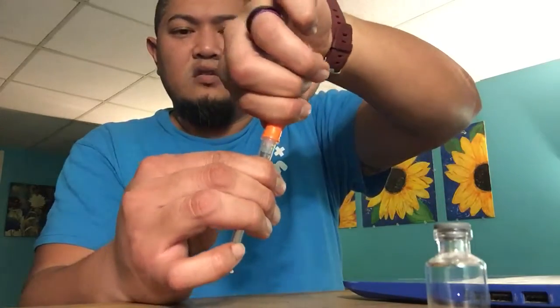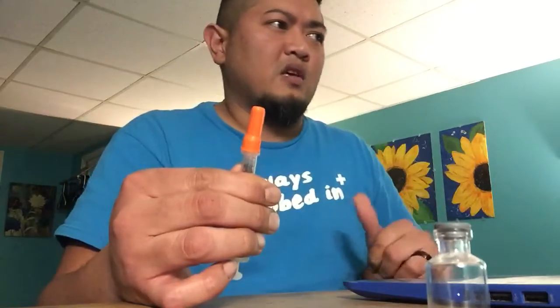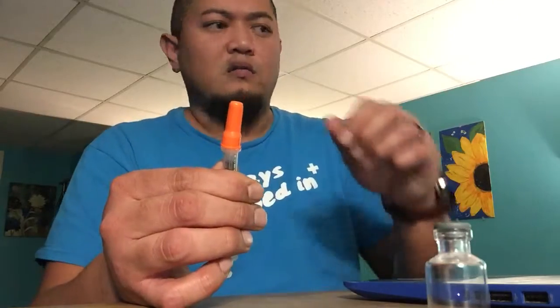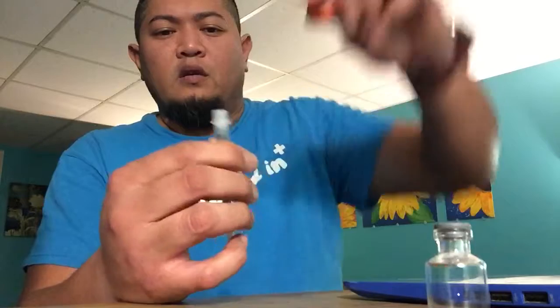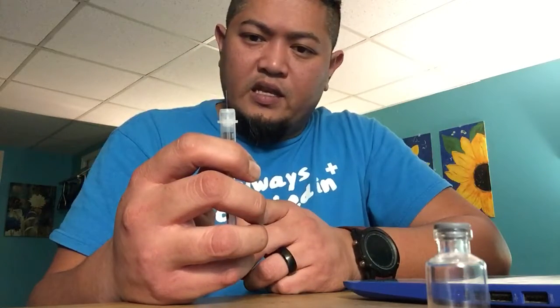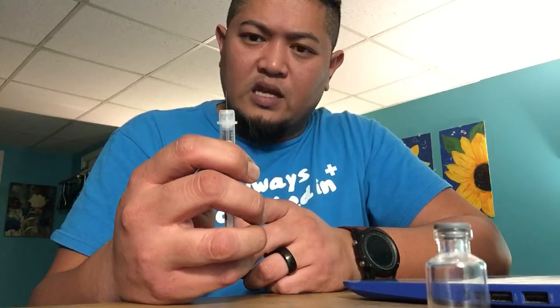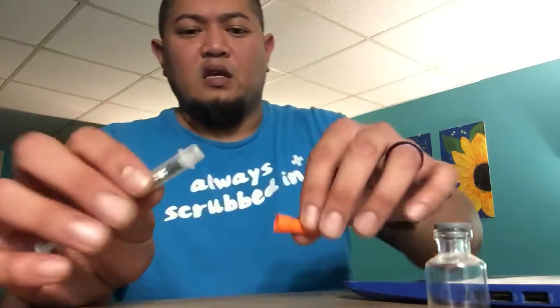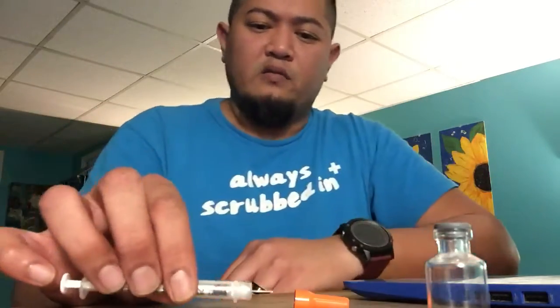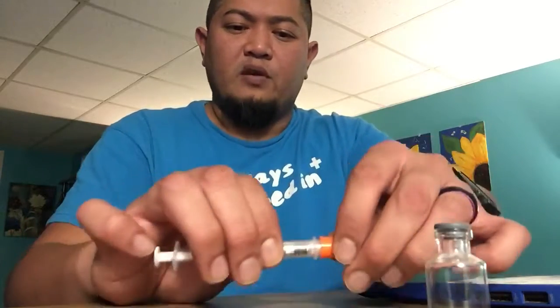with the needle, the right needle, which I think is 0.3, 0.5, or 1. Make sure you advance a little bit of the medication inside the needle on that dead space. And again, I'm not too fond of it, but safely recap it.